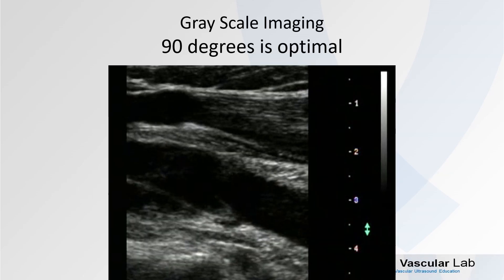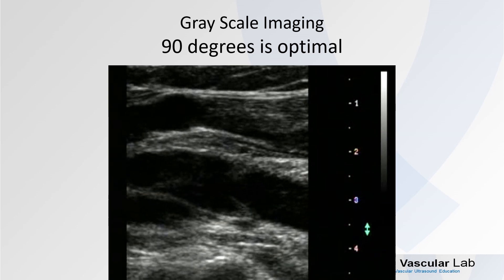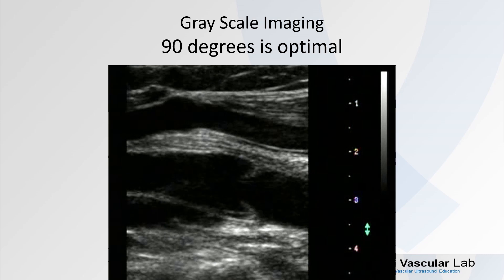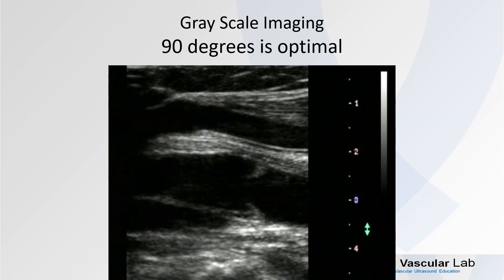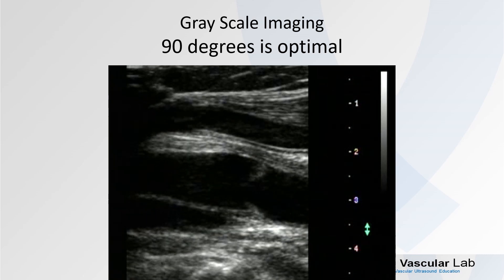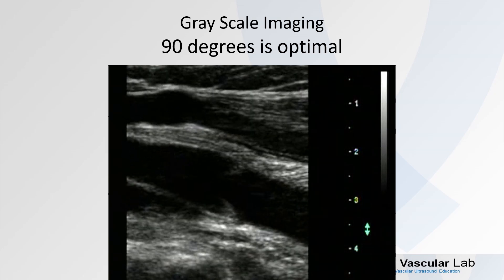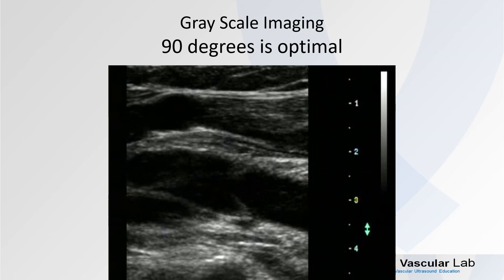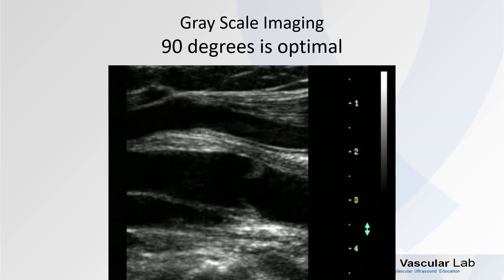Here's a pretty nice image of a popliteal vein, and we can see the valve in there. However, notice when I use the heel-toe maneuver and now strike that tissue at closer to 90 degrees, how my image improves. So remember, grayscale imaging — 90 degrees is optimal.